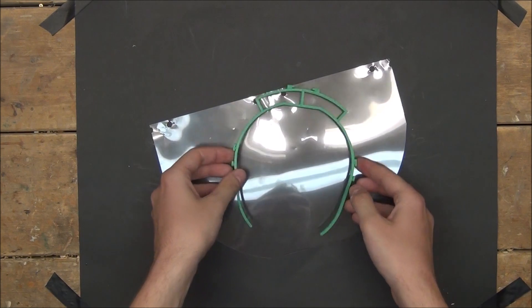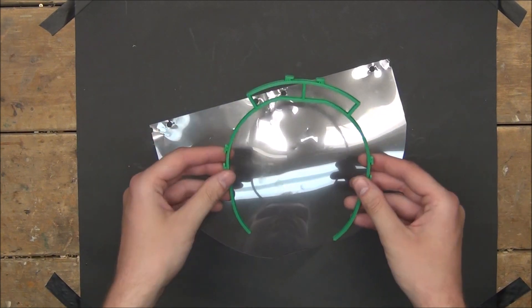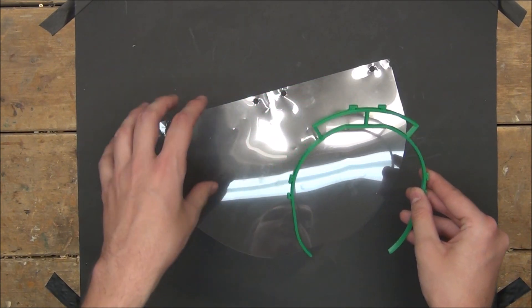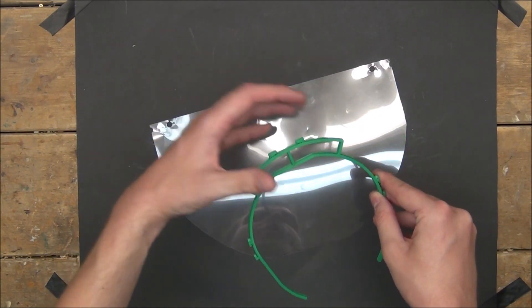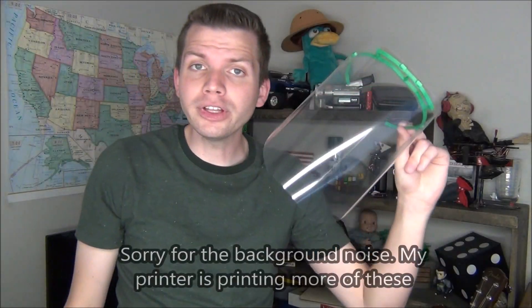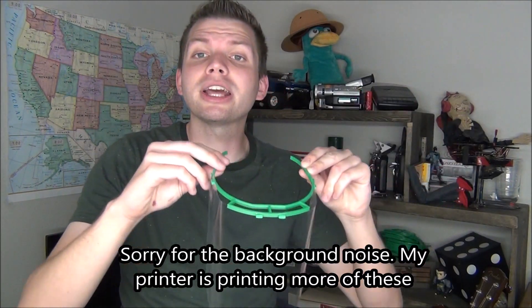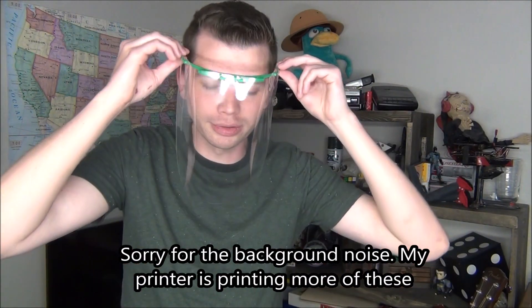And then your bracket is ready to be wiped down, sanitized, and have a new piece of plastic put on it. And with that, your face shield is complete and ready to be worn.